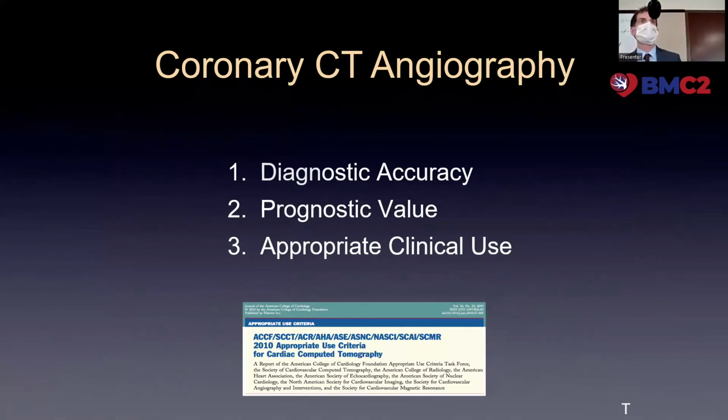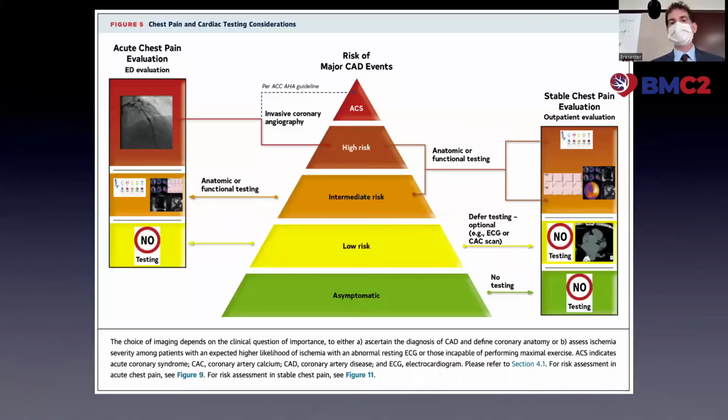So coronary CT has clear prognostic value. I think it's a valuable tool for us, for our patients. It's accurate. And then I want to show some cases of typical appropriate scenarios where we like to use coronary CT, where it's considered appropriate by guidelines and is helpful.